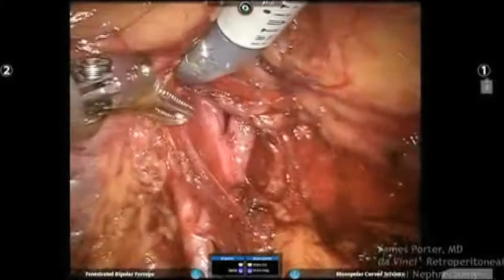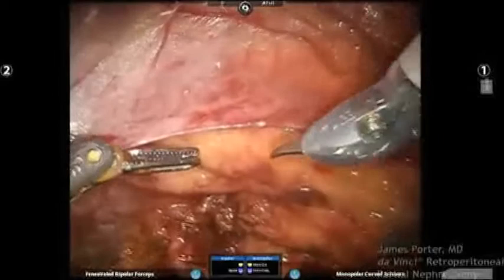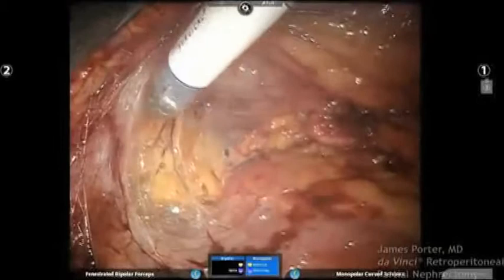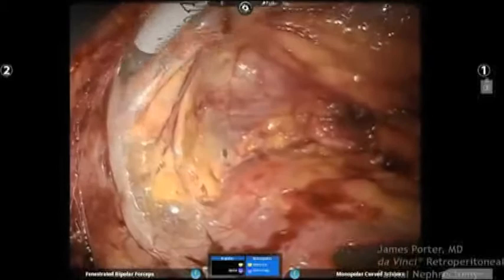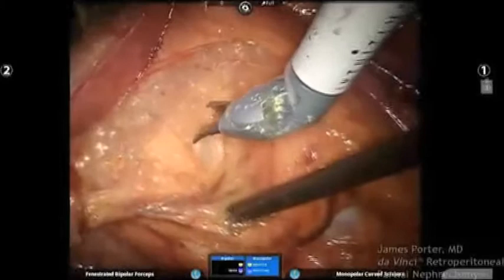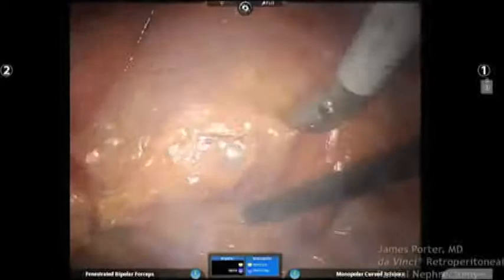So, there's been a lot of work to look at whether one can generate cold ischemia using an ice flush model, but it's difficult to get the slurry particles fine enough to get through the 12-millimeter trocar and then to extract them in a timely fashion. People have looked at using cold irrigation to cool through the irrigator aspirator, but the runoff is always a concern on the bowel. And we've looked to do a retrograde fashion to essentially place a dual lumen catheter and irrigate ice cold saline.